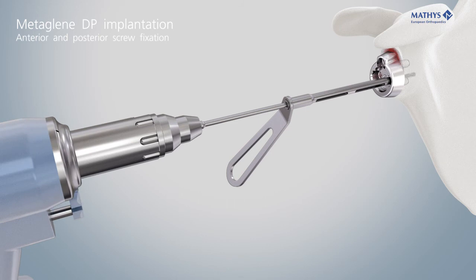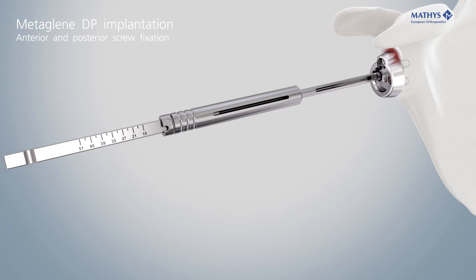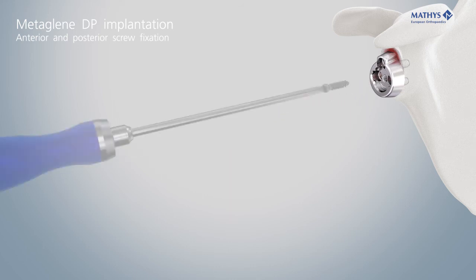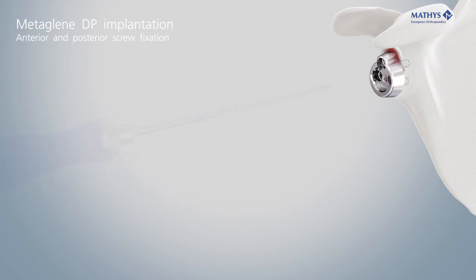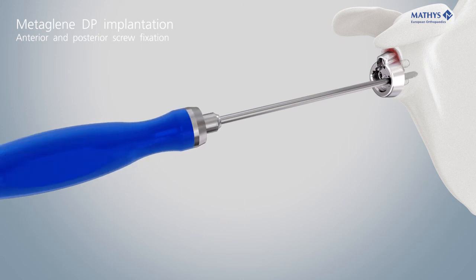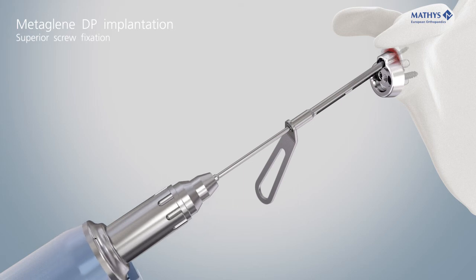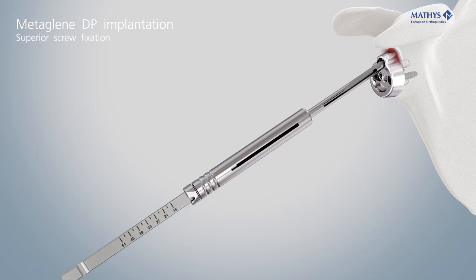The screws can be aligned with an angular freedom of plus or minus 8 degrees. Measure the depth of the holes with the depth gauge LC to determine the appropriate screw length. Insert the two screws with the screwdriver T20 and tighten them alternately. Insert the superior screw, which can be oriented with an angular freedom of plus or minus 10 degrees to the neutral axis of 20 degrees.